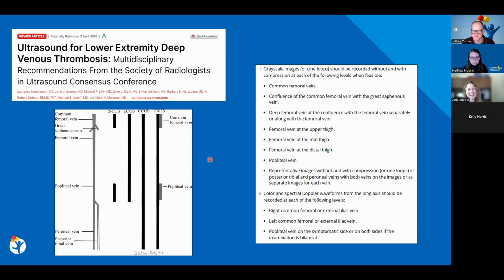Can you tell? I'm still not sure what to do. Probably we should change it, but I don't know about 10. Is that too young? Yeah, probably a good age, probably is, actually. I might need to revisit that. It would be interesting to go back and look. We've been doing this for a good bit now, and I'm not sure I've seen any calf clots in any of the ones that I've read. Kelly, you probably get exposure to more of them, but have you seen any that we just picked up in the calf that didn't have focal symptoms?